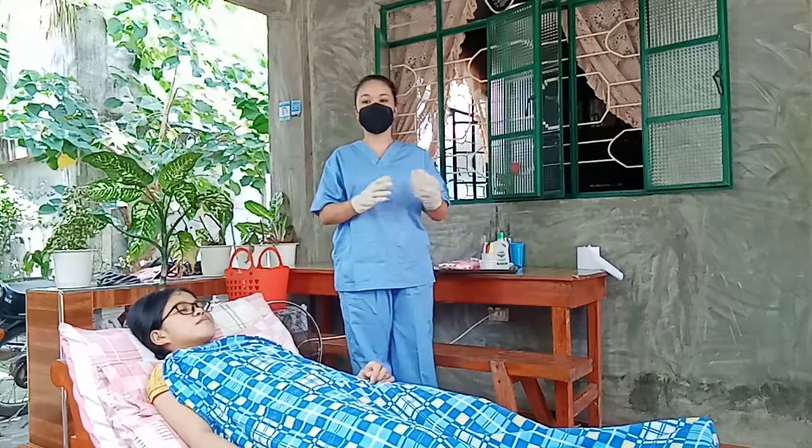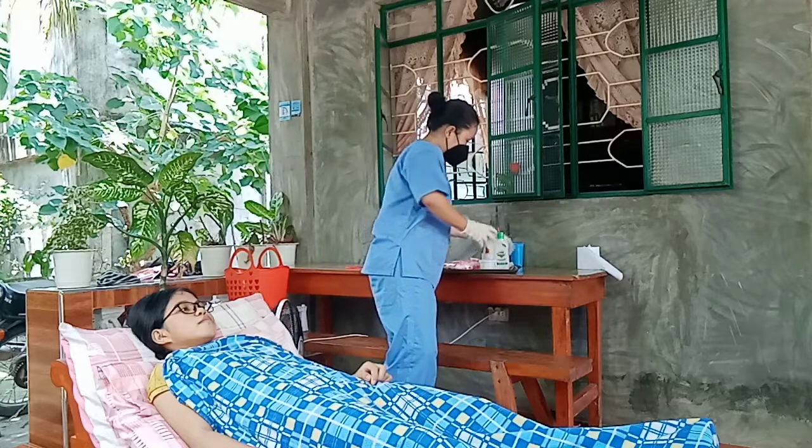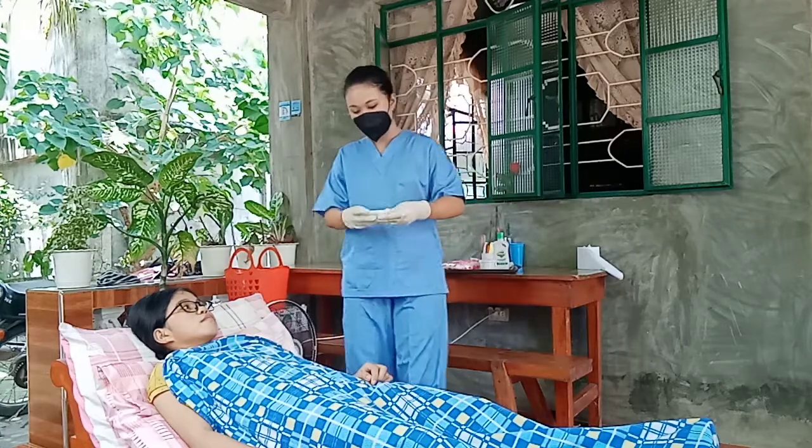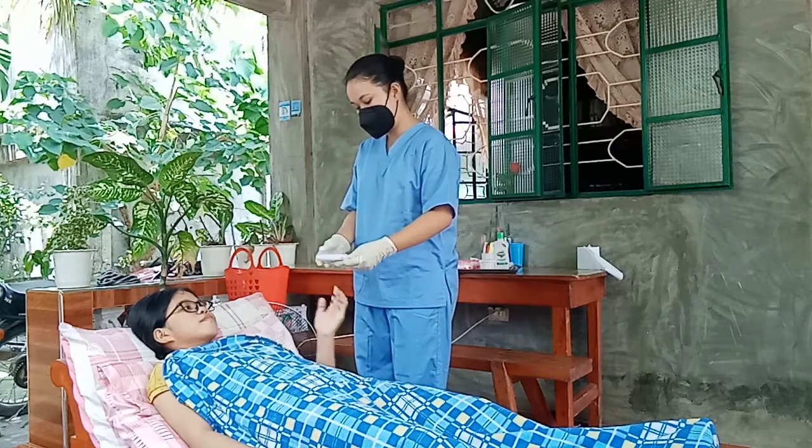The next is give patient supplies to clean perineum. So, ma'am, I will give it to you, then you clean your perineum.